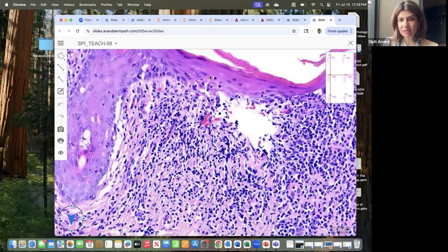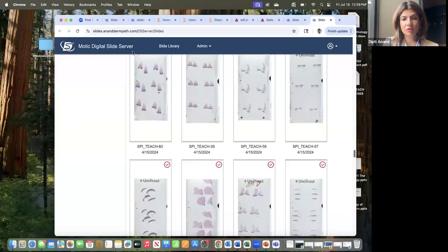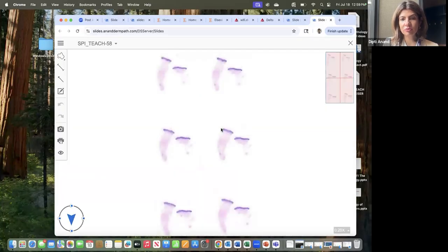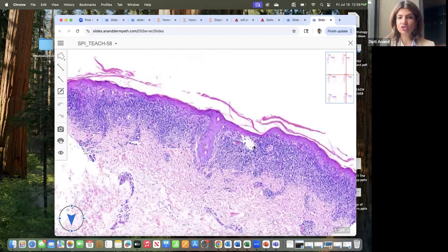So secondary subepidermal blister from your lichenoid inflammation is a Max Joseph space. Don't have a better example in here. When we do blistering diseases, we'll see more, but you got the thing, right? When there is secondary subepidermal vesiculation from lichenoid inflammation, that's your Max Joseph space.